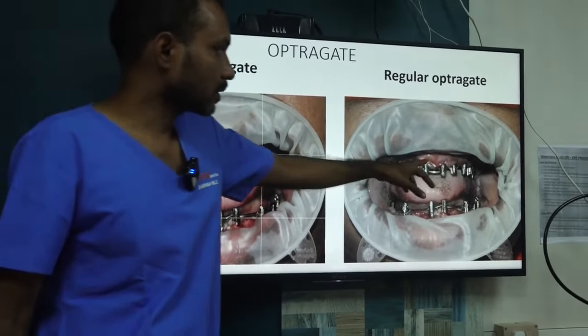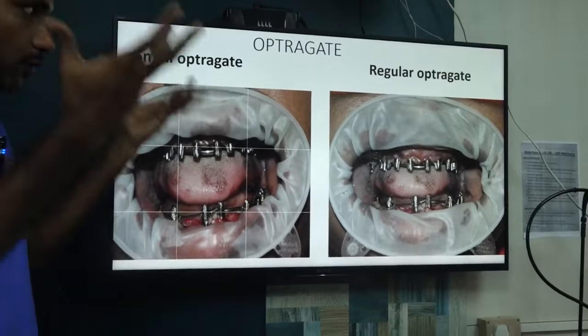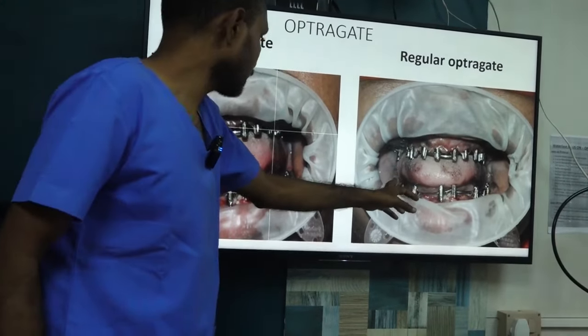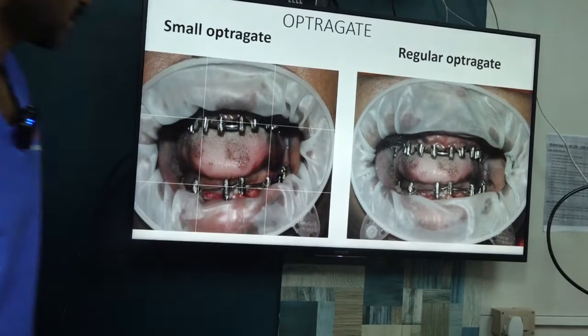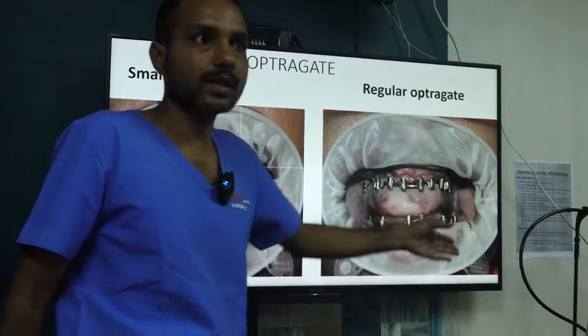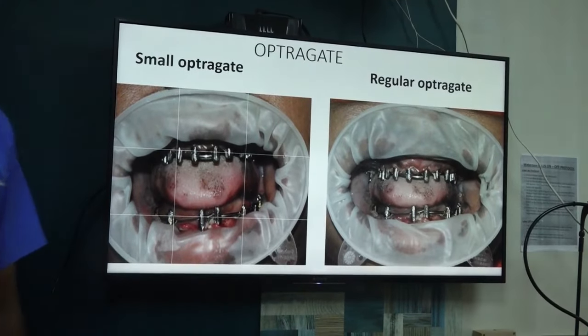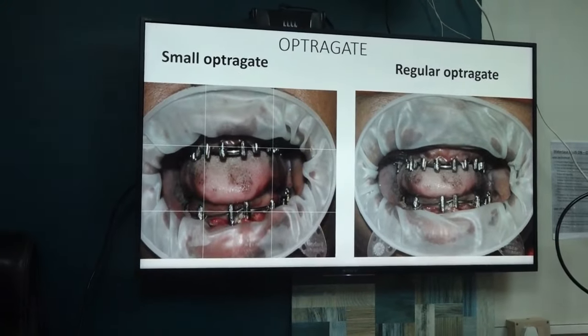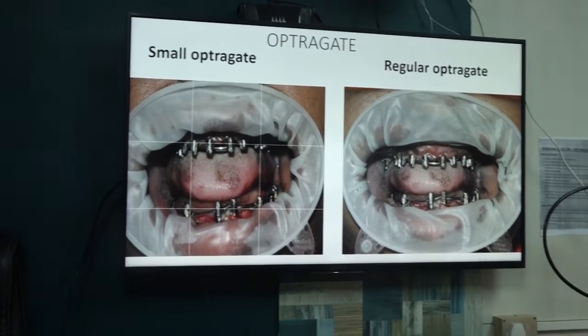See the amount of retraction you can get. It retracts the lips and cheeks fully, and you get more space when you put the scanner. Placing the scanner head in the buccal sulcus is very easy, right? Because it gives more room in the buccal area. Next.